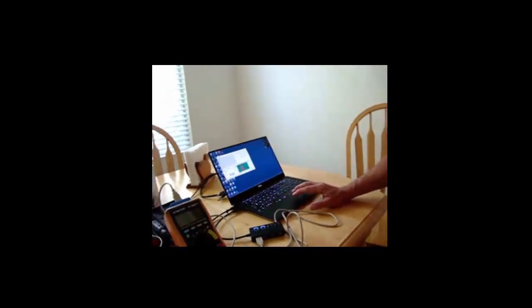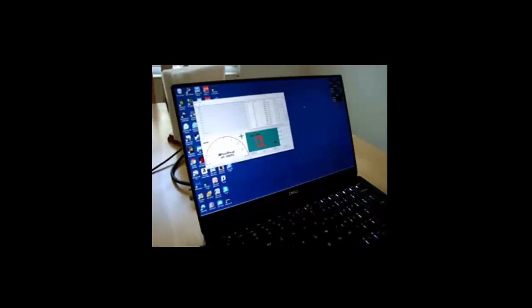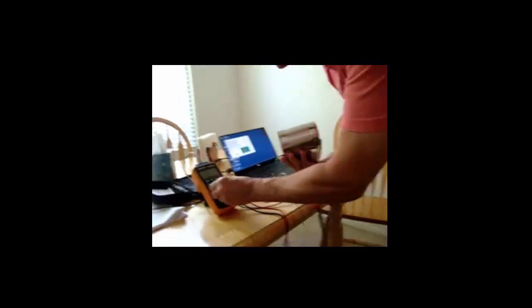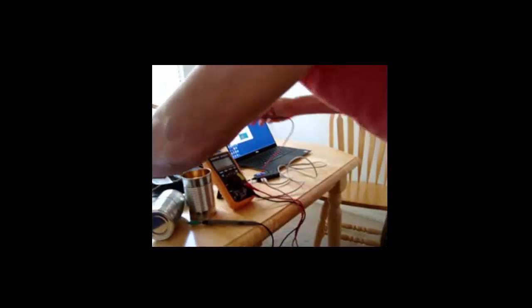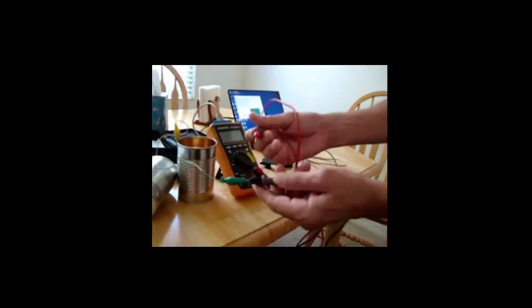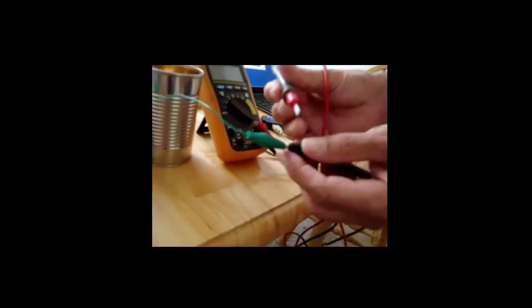Usually doesn't work the first time. Okay, so now we've got this going on COM port 4. And now notice that when I pick these up and turn this on, okay, notice that if I just connect the two leads together, there should be no resistance because they're in common contact with one another, and they're both conductors. And you can see on here that it goes to 0.